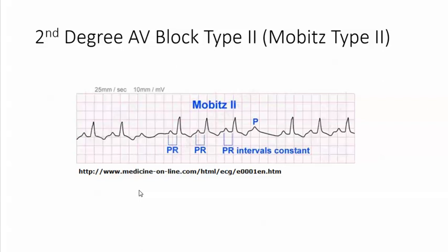In this rhythm strip, the first thing we're going to do is look at the P waves. You notice the P waves occur in a regular rhythm. Now, not necessarily does the impulse conducted in the SA node make it all the way to the ventricles. When that happens, you have a P wave and no QRS — so some P waves do not have a QRS. The atrial rate is 94 beats per minute and it's a regular rhythm.